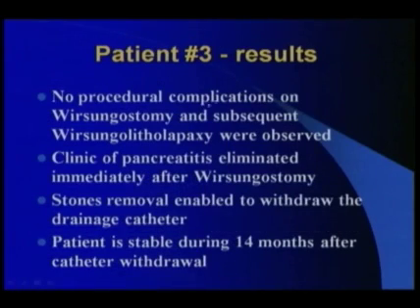So results: again, no procedural complications were observed on the wirsungostomy and subsequent wirsungolitholapaxy. Clinic of pancreatitis was eliminated immediately after Wirsung duct drainage. Stones removal enabled us to withdraw the drainage catheter, and the patient is stable 14 months after the catheter withdrawal.